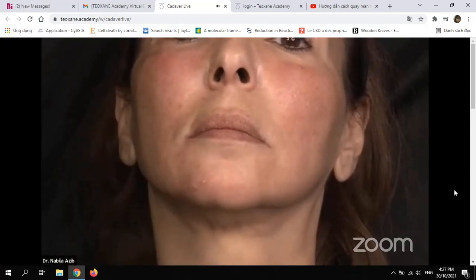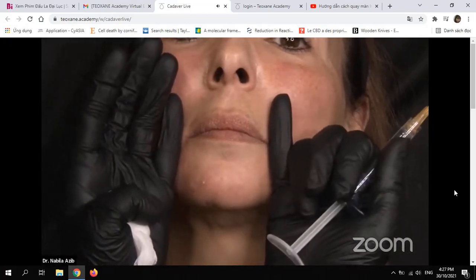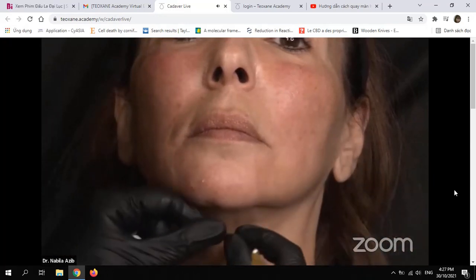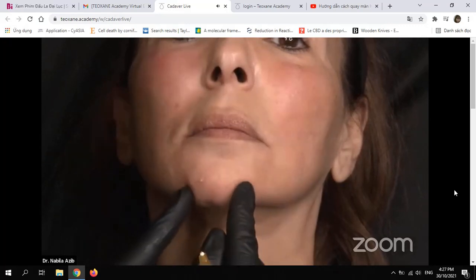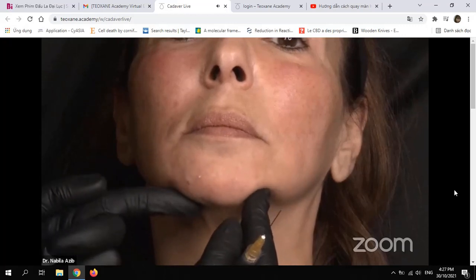And what about the male drawing for the injection of the chin? That is my landmark for male, the width of the lips, because I need a squared and larger chin in a male patient like this. But in a female patient, I prefer a more pointy chin, less wide than a male.